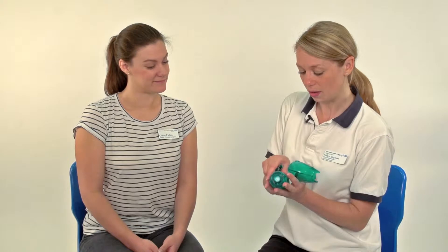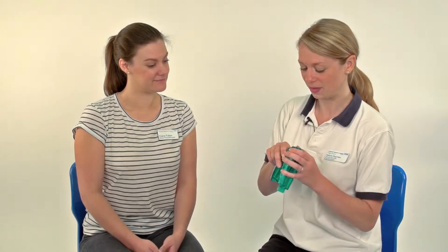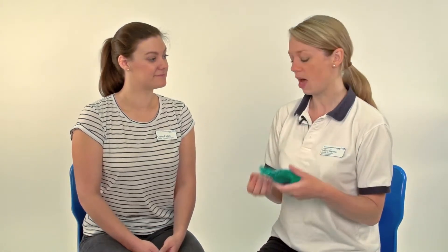So what I'm going to do is put this back together and then let you have a try using this and see how it feels. The only time we don't necessarily use an Acapella over other airway clearance devices is if you've got quite irritable airways. Sometimes people with asthma or irritable airways find that the oscillation actually irritates their airways too much and they don't tolerate it very well and it can make them cough quite a lot. So it's something you'd need to discuss with your physiotherapist to see whether this is the right choice of airway clearance technique for you.